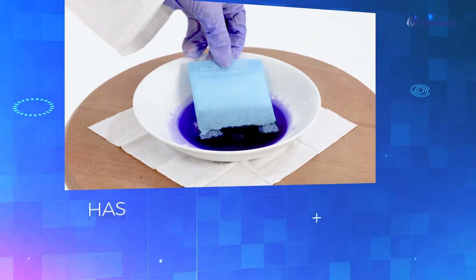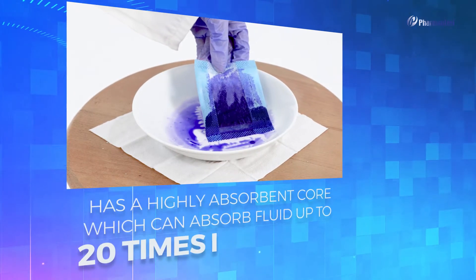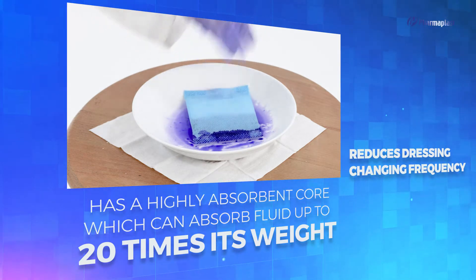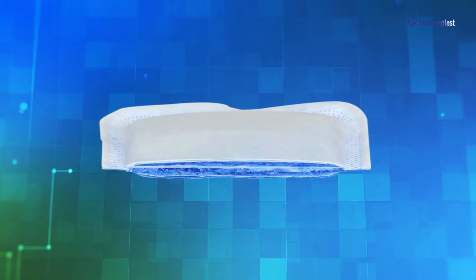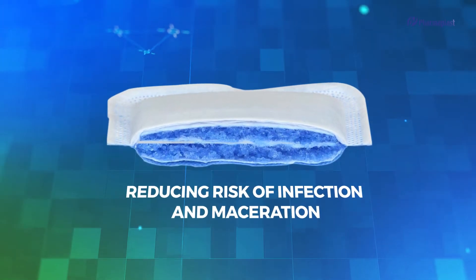XORP has a highly absorbent core which can absorb fluid up to 20 times its weight. This reduces dressing changing frequency, and the absorbent core locks away bacteria and harmful proteases, reducing the risk of infection and maceration.